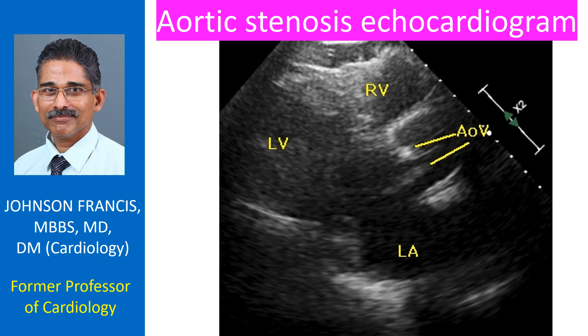This is the parasternal long axis view, which shows the outflow region of the right ventricle, interventricular septum, left ventricle, left atrium, and the aorta.